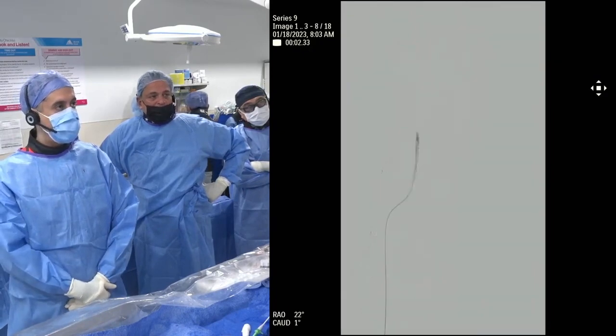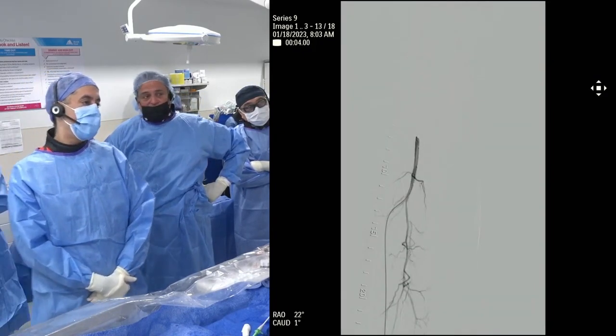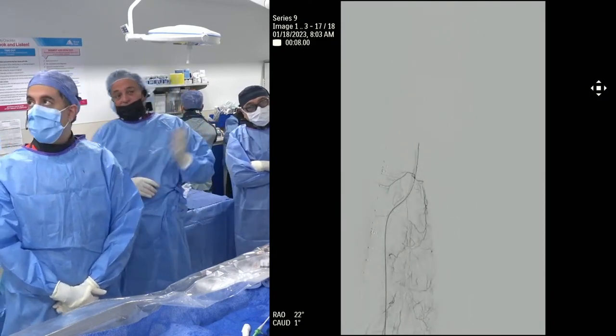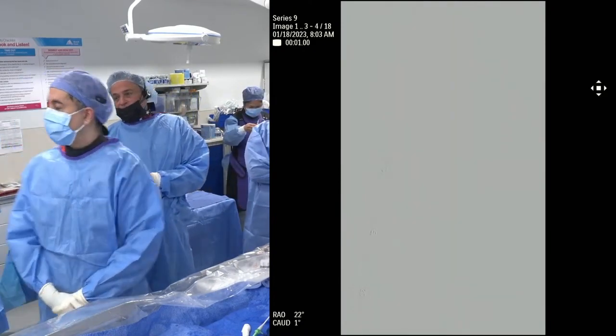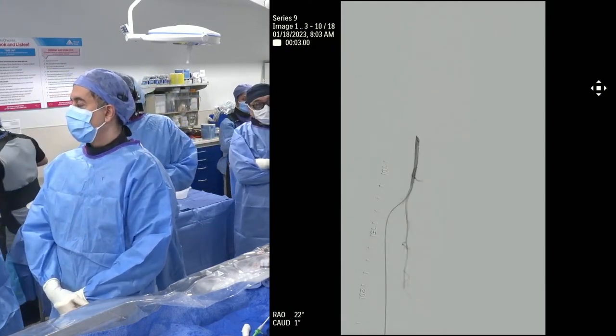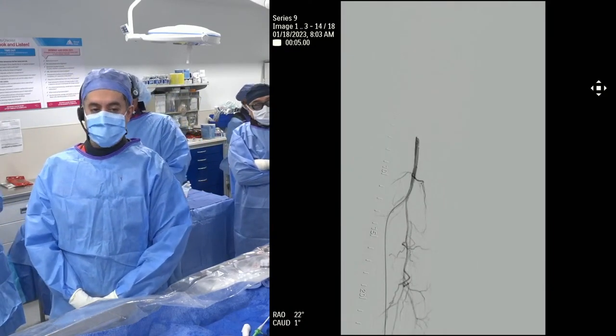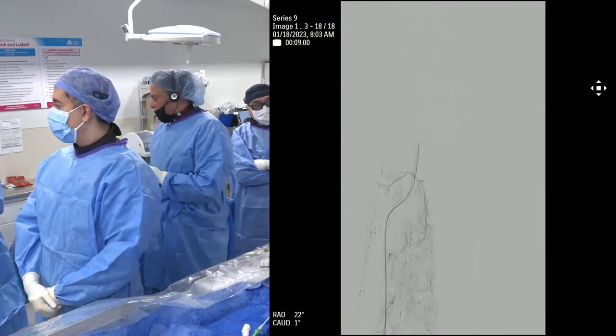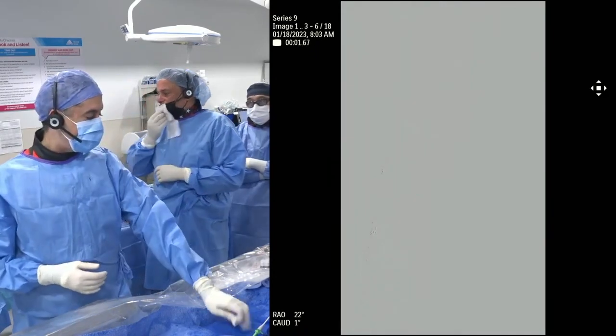So one of the thoughts is, what about going up and over? I mean, Ajit, obviously you're the vascular surgeon. If we go up and over with a Simmons 3 catheter, get enough nose, bury our wire in the distal SFA, track a steerable sheath up and over, what are the dangers to the graft for doing this? What can happen? Are there things we need to worry about?